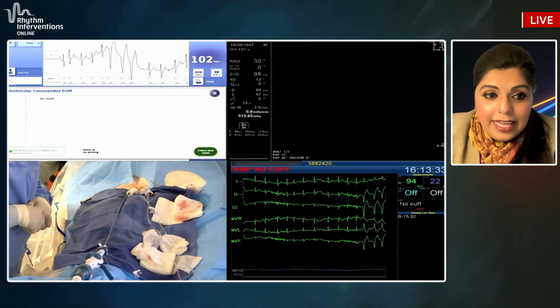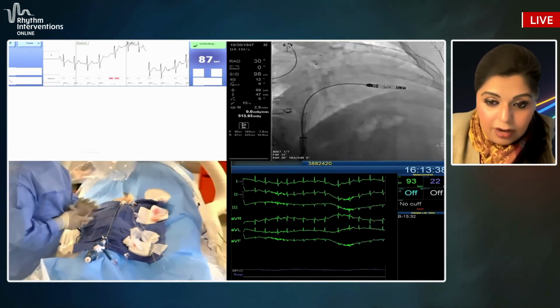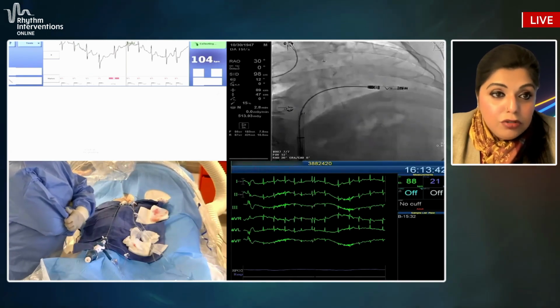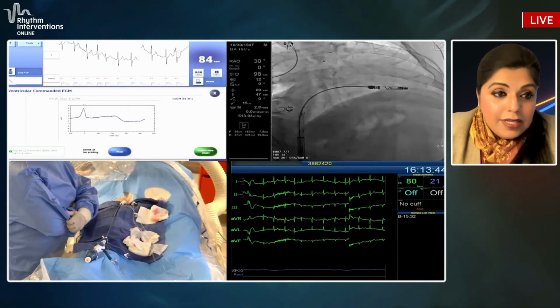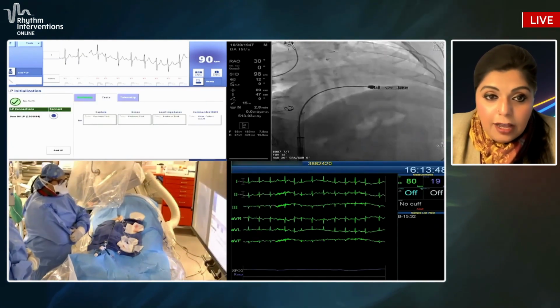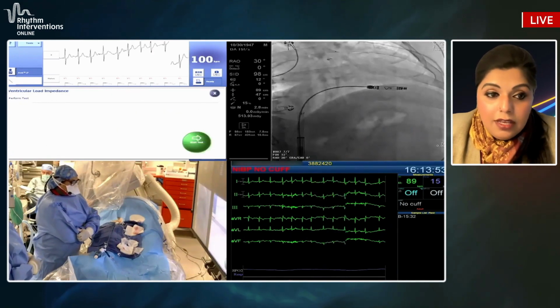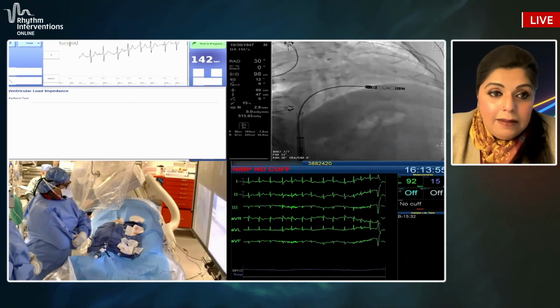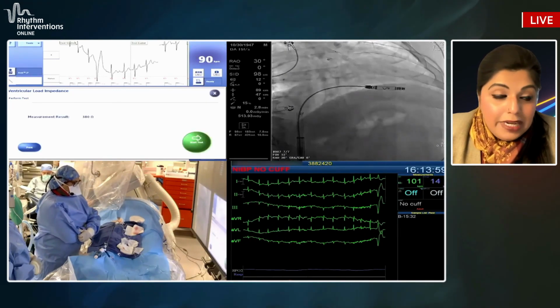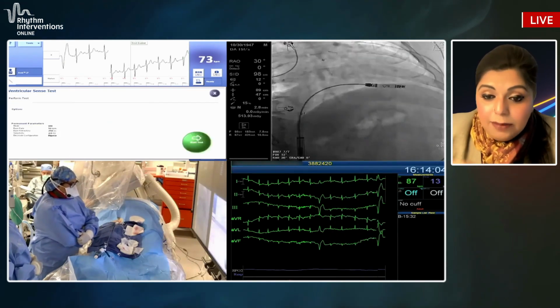The clinical team is actually getting initial numbers. You can actually map, you can sense, you can get R waves, you can collect a baseline impedance, a baseline threshold. You can even get a current of injury. So you can see I have a slight current of injury, which tells me I'm not pushing forward. I don't have any forward force. I don't like to have a lot of injury before I implant. I'll get my R waves. I'll get my baseline impedance. So at least I'm starting at 380. So I'll keep an eye on it as I deploy the helix.